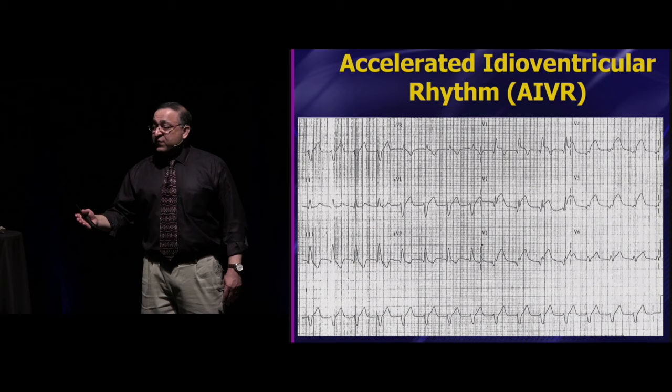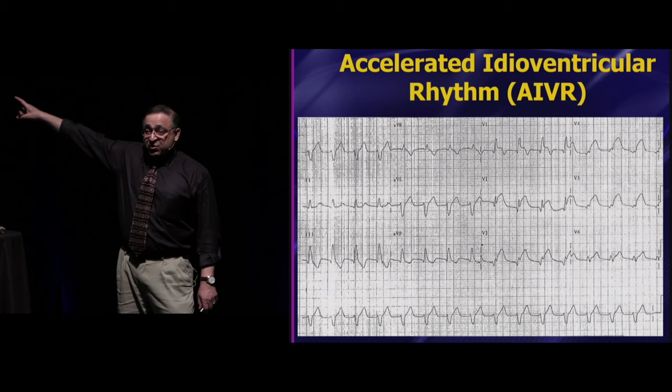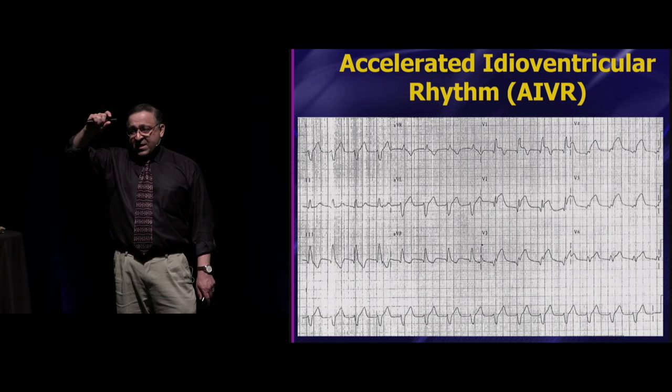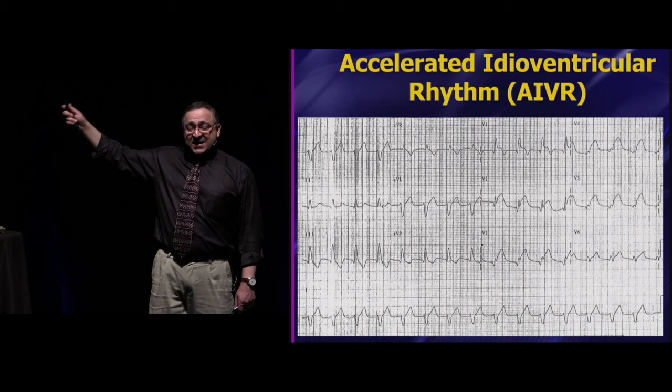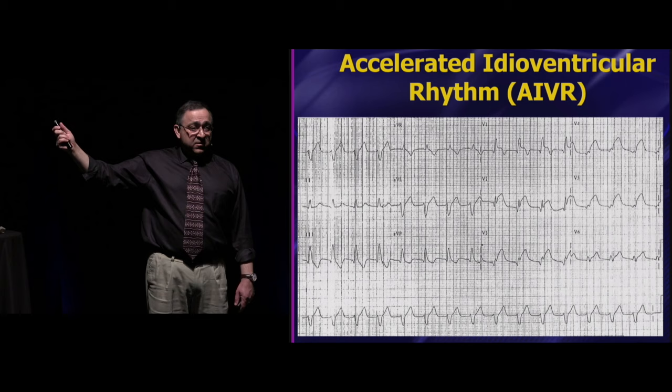Because they get this 12 lead and your computer, which is programmed to fool you, whoever programs those EKG machines, has a really evil sense of humor because they program them to fool you, all right? The computer's gonna call this VTAC. It's not VTAC because the rate's not fast enough. It's not 120, all right? But your computer's gonna call it VTAC anyway just to mess with you.